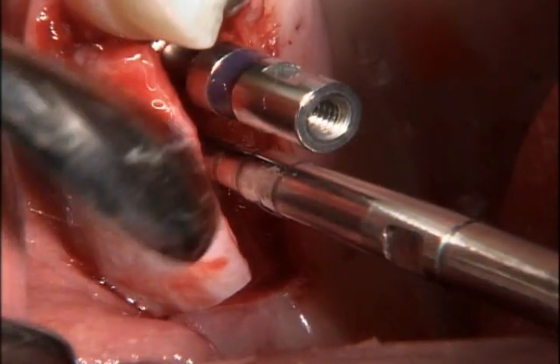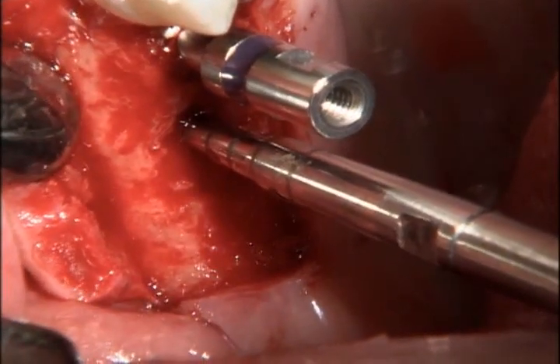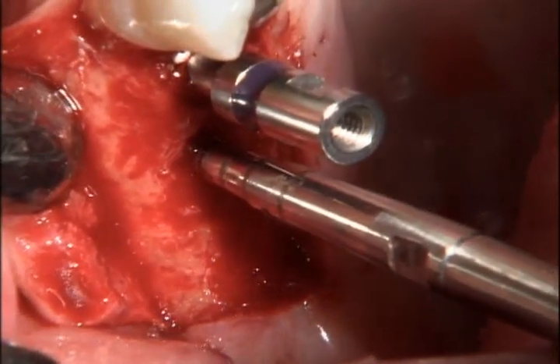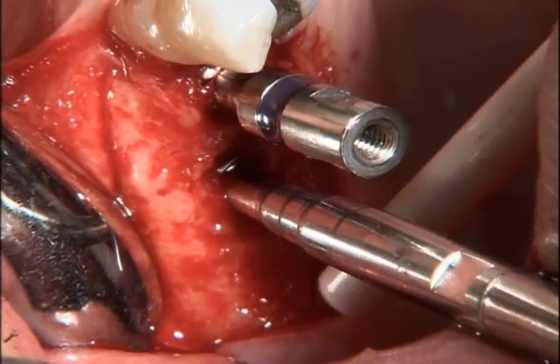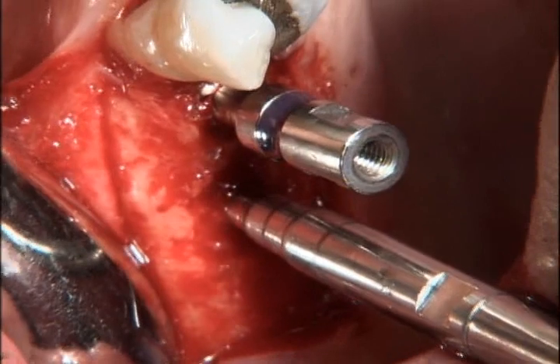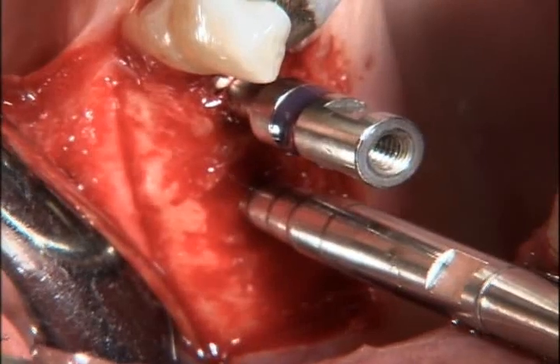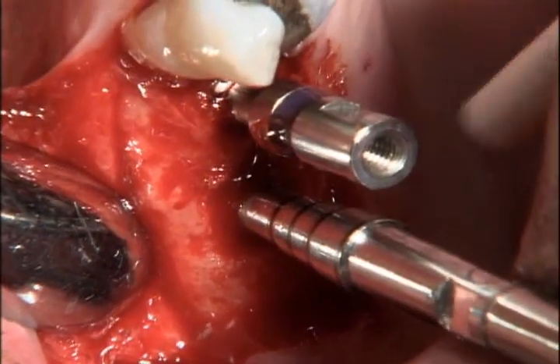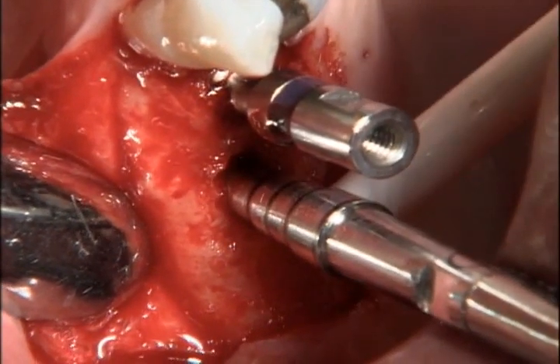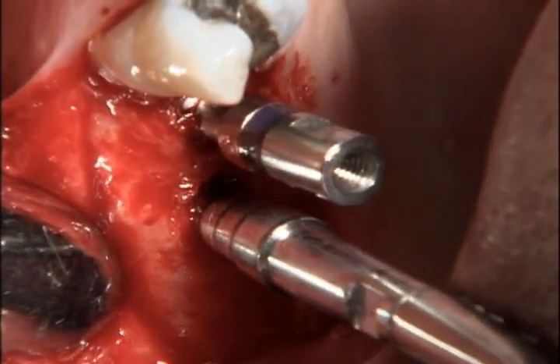The second implant site was then developed, beginning first with the smallest diameter or number 1 osteotome tip. In this site, there was only about 4 millimeters of bone remaining below the sinus floor. Knowing this, the osteotomy was developed to a depth just short of the sinus floor with all 3 osteotome tips, before upfracturing the cortical sinus floor with the largest diameter, or number 3 osteotome tip. A sudden reduction in resistance to the advance of the osteotome tip should be easily detected as this upfracturing occurs.